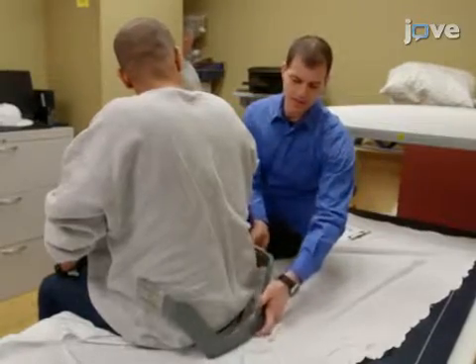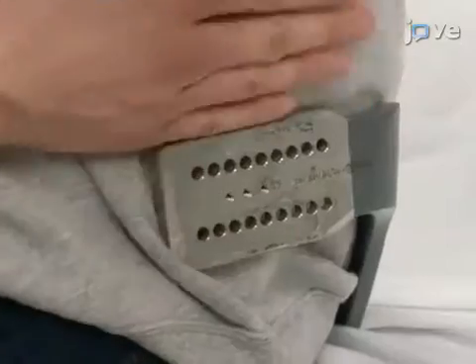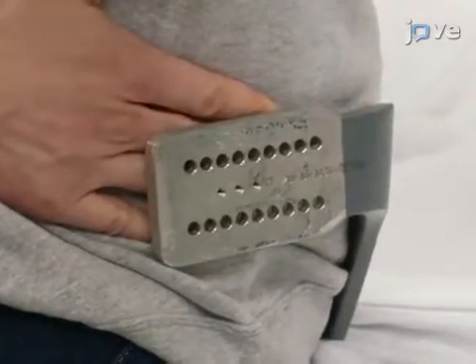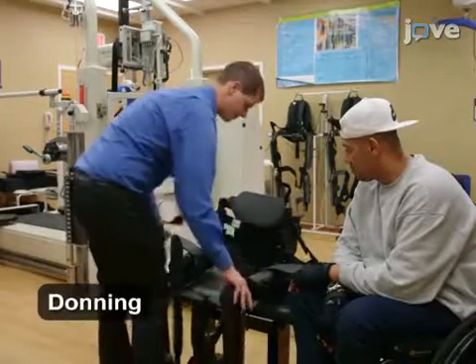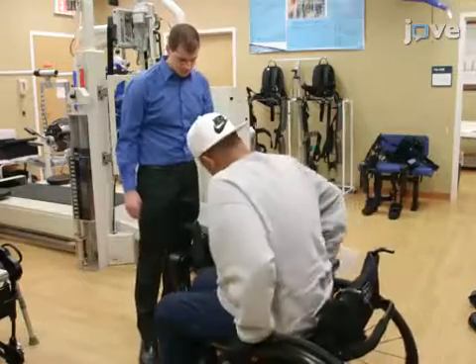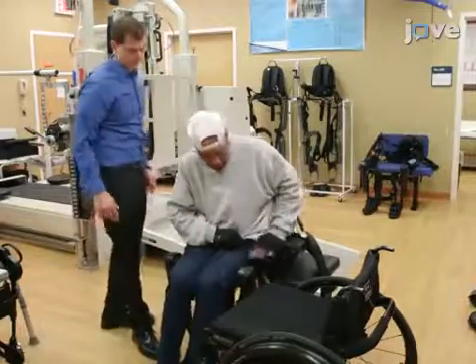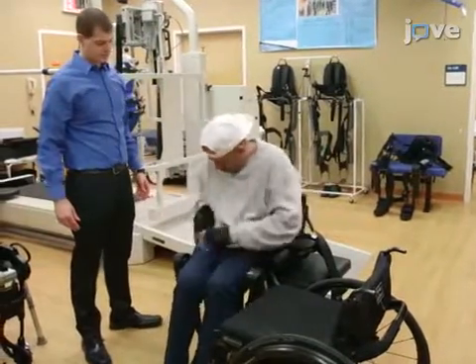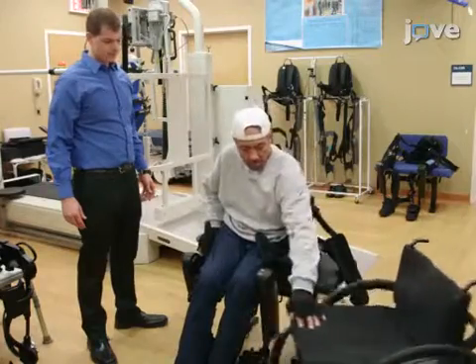Place the pelvic band closest in size to the participant's pelvic width behind the person and slowly move it forward to test for a fit. Next, place the exoskeleton in a seated position on a chair with an open back. Have the participant sit down in the device and instruct them to place their feet in the shoes. Continue securing the straps starting at the most distal point and moving proximally up the body, finishing with the chest straps.